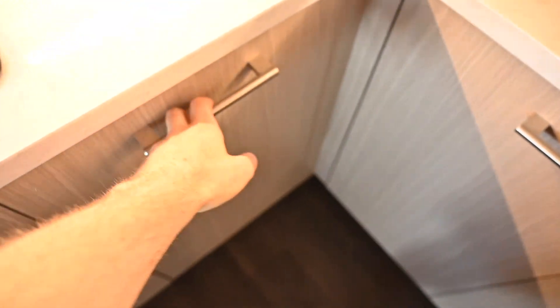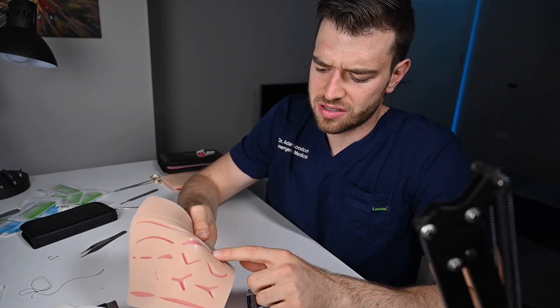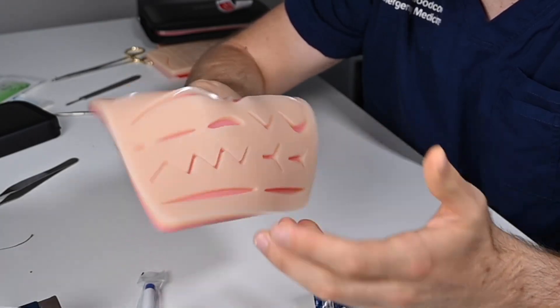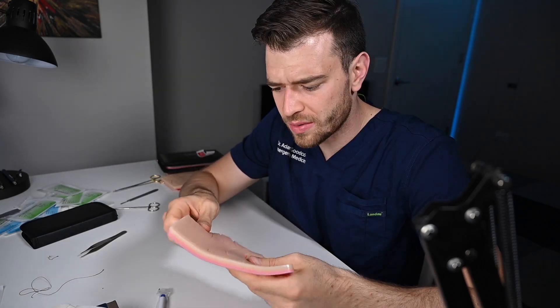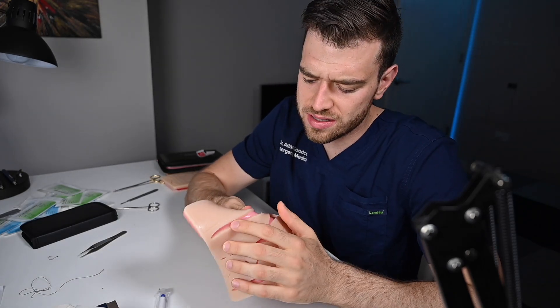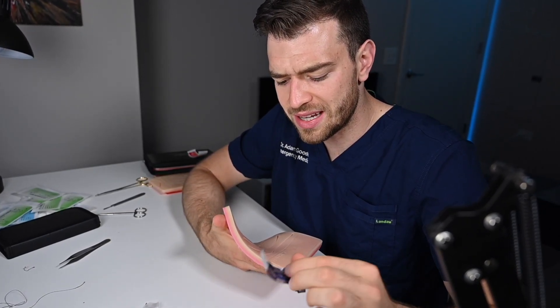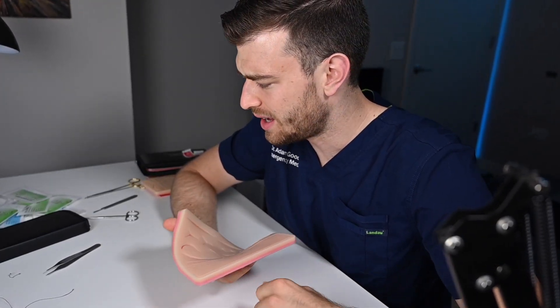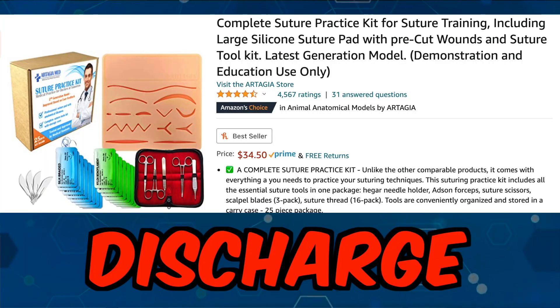This is the last suture pad — the Artagia one. The wounds are just strange. It's very floppy and easily deformed, and it just didn't feel real going through it. The first suture pulled out so easily. It did come with sutures, and randomly came with scalpel blades that had no handle. It had no tools, but a lot of sutures. I would not recommend this one. For me, this is a discharge.